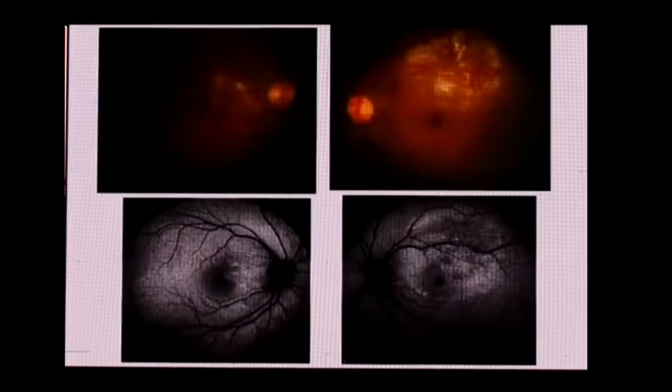One thing which was interesting is this post-viral retinitis, which we are beginning to see more often. Some of them respond very well and they have a very good prognosis. Some of them land up with a lot of exudation. So again, this is one such case, post-chikungunya, and this patient was on steroids as well.